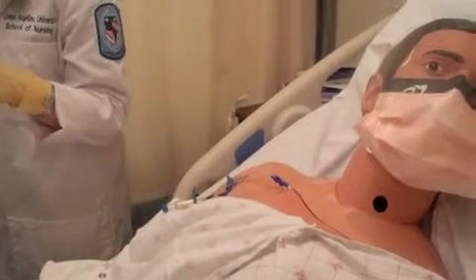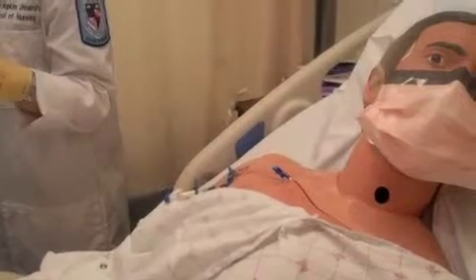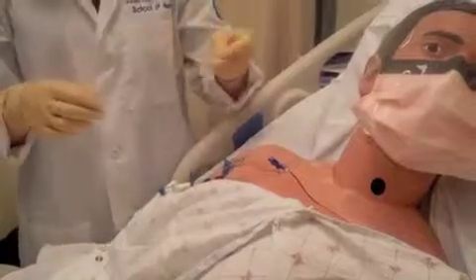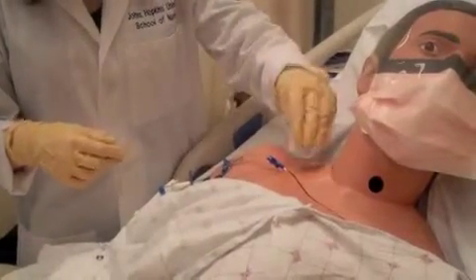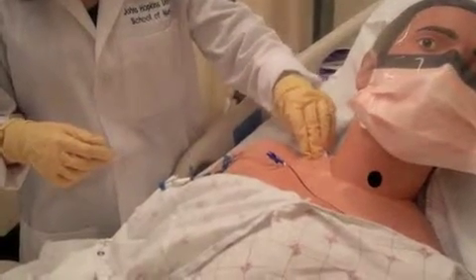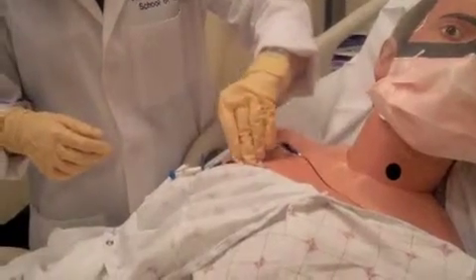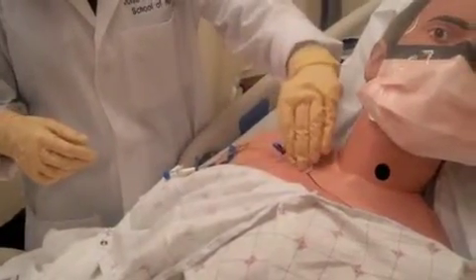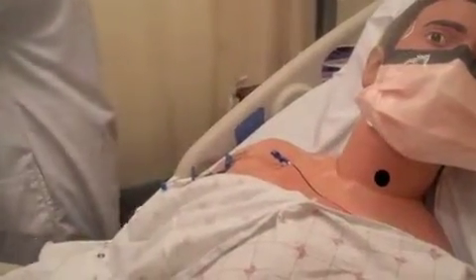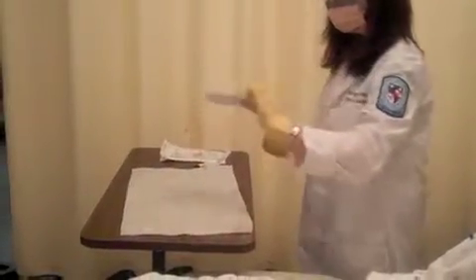Now using the unsterile hand, pick up skin prep packet and remove skin prep pad with sterile hand. Apply skin prep on outer perimeter of skin where the dressing edge will touch the patient. Do not put skin prep over the catheter insertion site or the immediate surrounding area, and allow to completely dry. Apply transparent or gauze dressing per manufacturer recommendations.